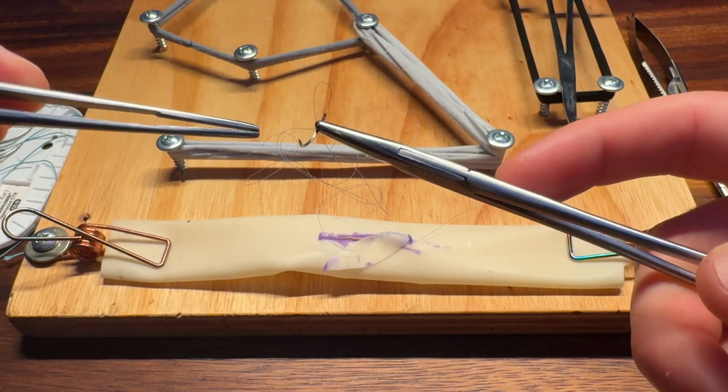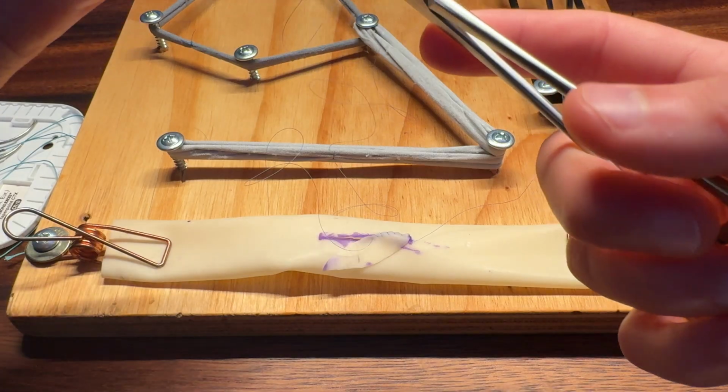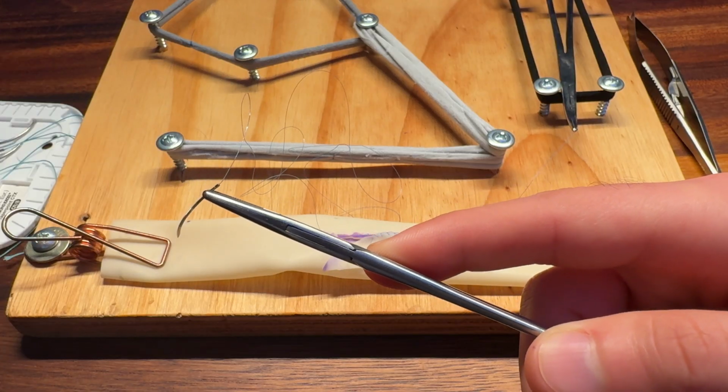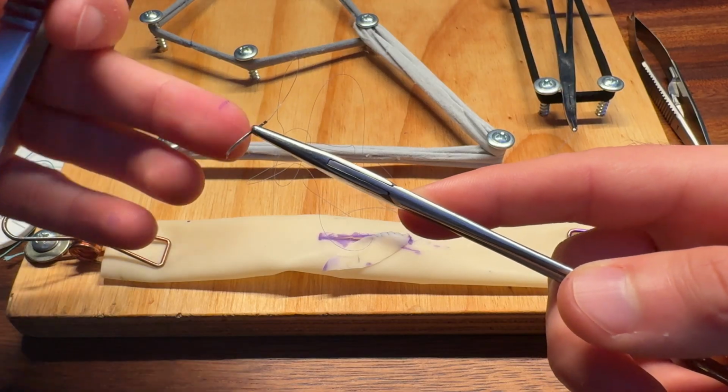And that's more commonly what I've seen in the OR, because whenever you're cutting into a tissue, a lot of times you're putting a lot of torque on this part of the needle, right? So if you have a normal cutting needle where the edge is here at the top, it's going to really slice there. It's going to create more trauma than if it's on the bottom side.